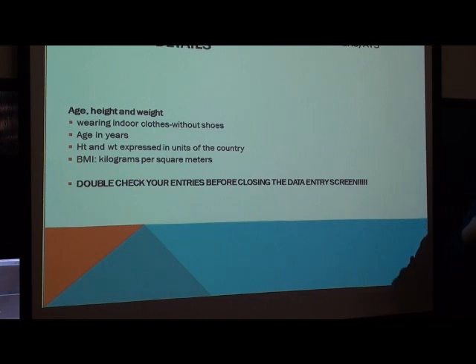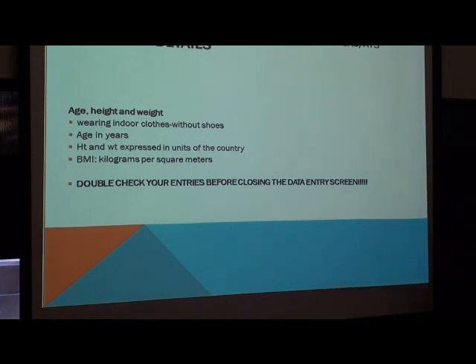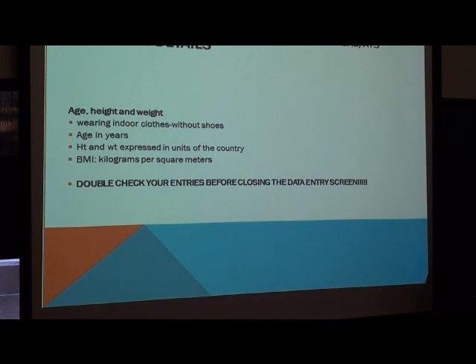Once you save it, you have started into play. You're basically saying, everything in here is accurate. We now know how to evaluate this patient's lung function, which we all know to be individual to that patient. So this is a really important point. You can do everything else perfectly, but if you make a male a female, then we're expecting less. The reference yardstick is much, much smaller than it would be for that individual. And so you might miss disease that reflects a low vital capacity.